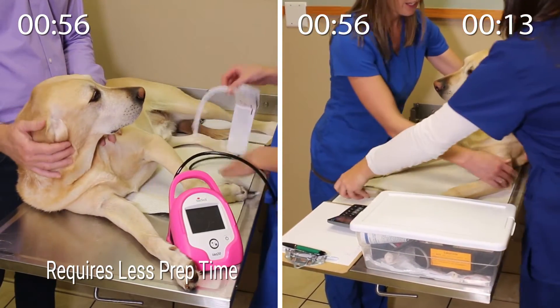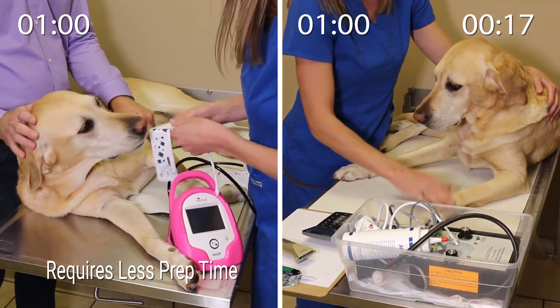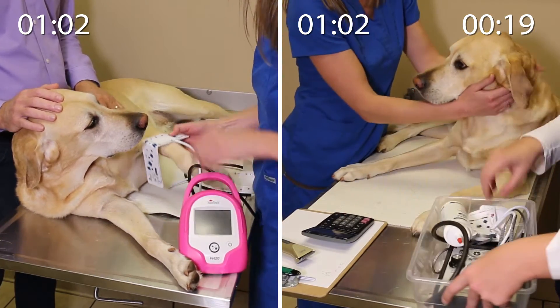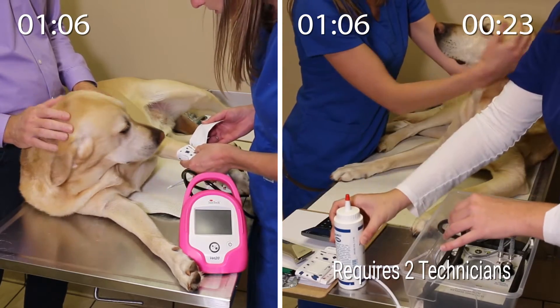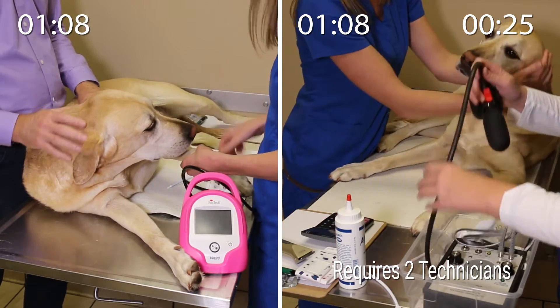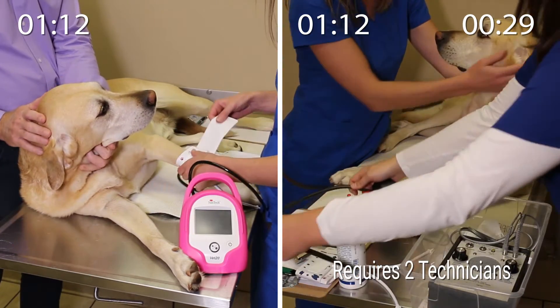As the technician sets up, you will notice the VET20 requires significantly less effort to prepare Tucker for his BP measurements. Often for Doppler, the technicians will perform the measurement in another room, so Tucker's owner has left the room in this case. Additionally, another technician has come in to assist in the Doppler reading on the right-hand side.